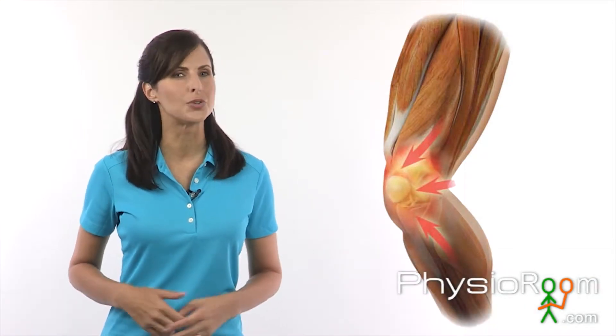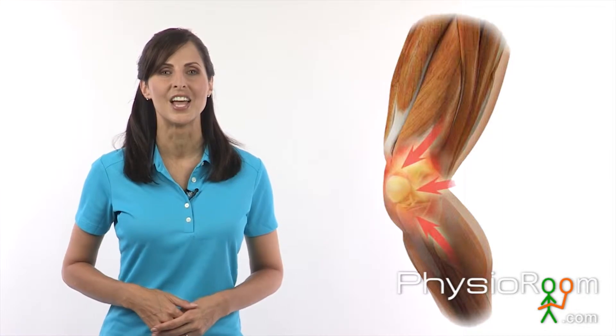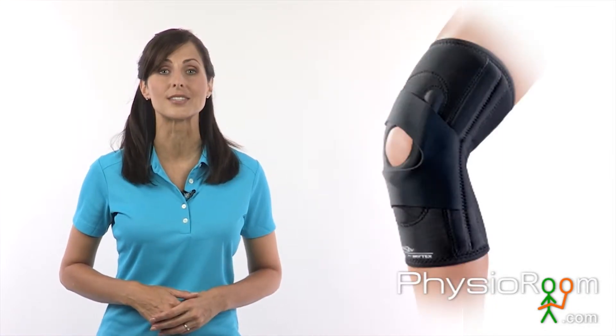If you're suffering from knee pain due to lateral patellar dislocations or improper patella tracking, the Donjoy Lateral J Knee Brace can help.